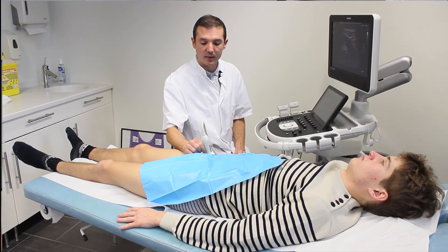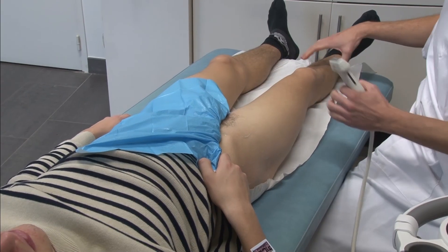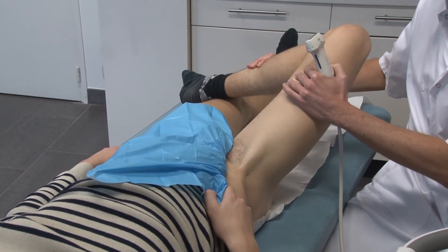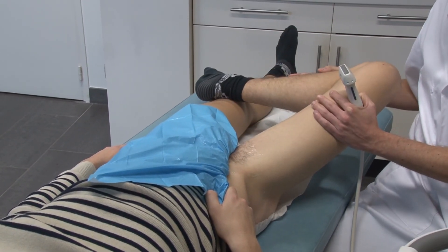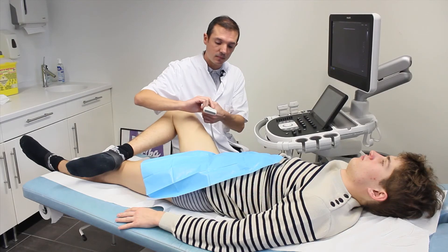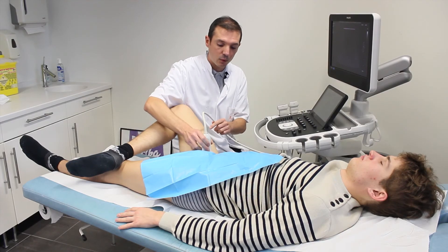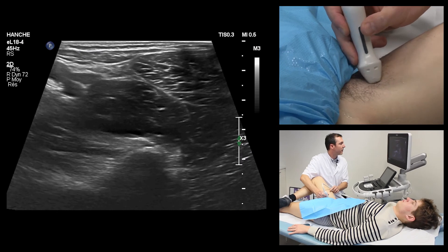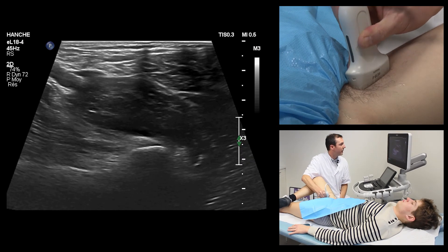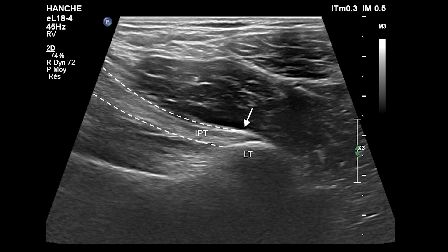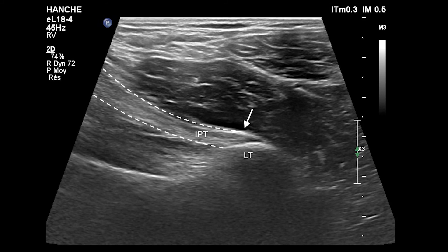An additional sagittal plane carried out with the FABER maneuver — acronym of flexion, abduction, external rotation — consists of placing the foot of the leg under study on the opposite knee. This maneuver permits a complete longitudinal view of the distal iliopsoas tendon up to its insertion on the lesser trochanter.